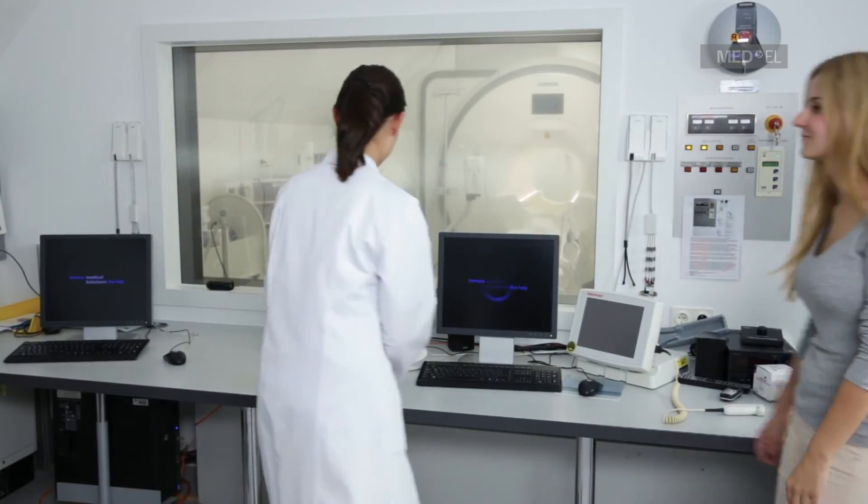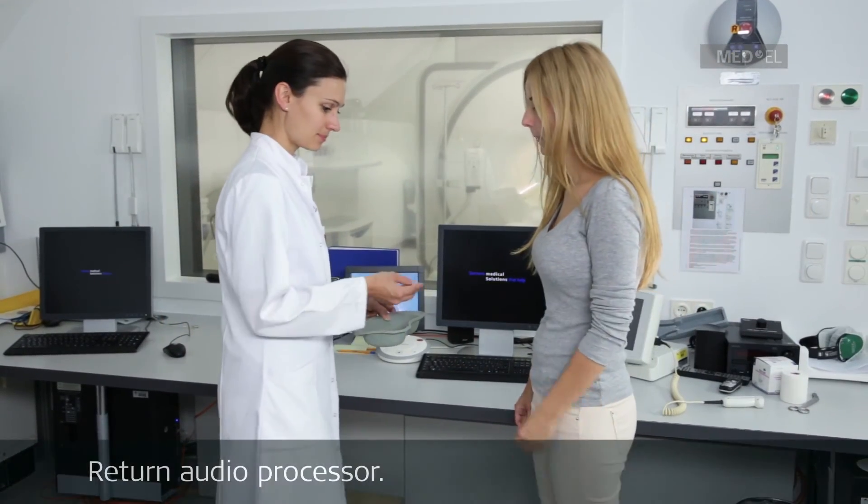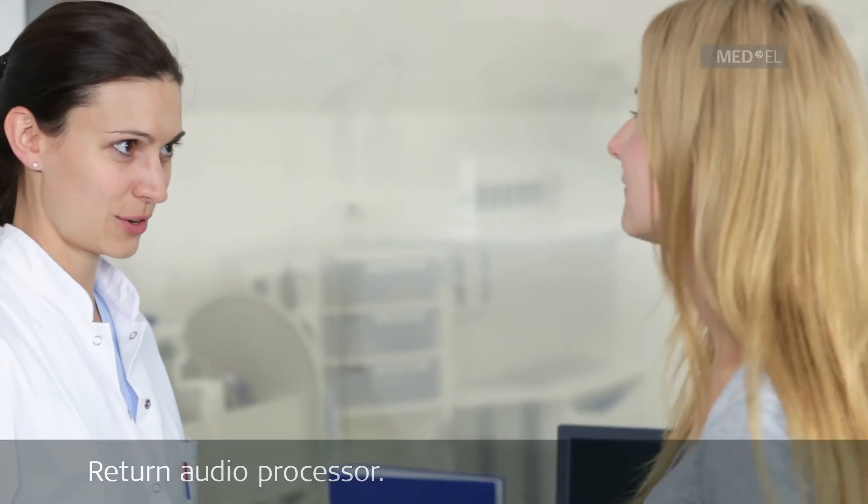After the MRI examination, the patient should put on their audio processor only after leaving the MRI room. By following these basic conditions, you can safely MRI scan a patient with the BoneBridge BCI-601 implant. Please contact your local MEDA representative if you have further questions.